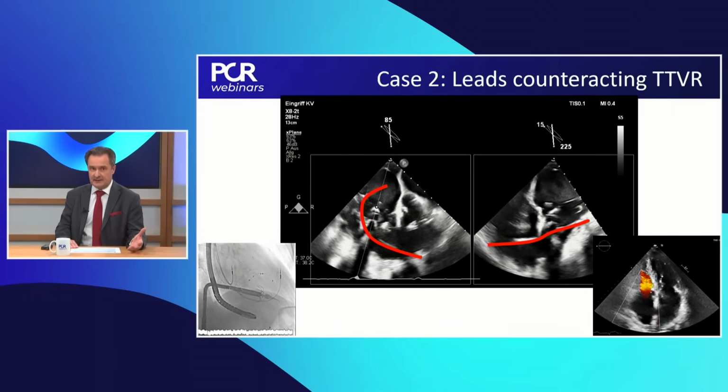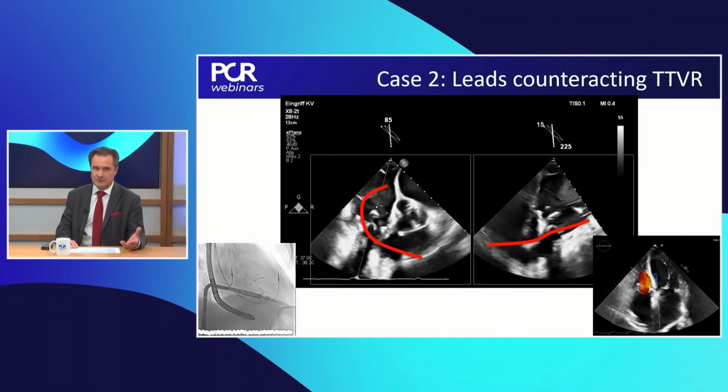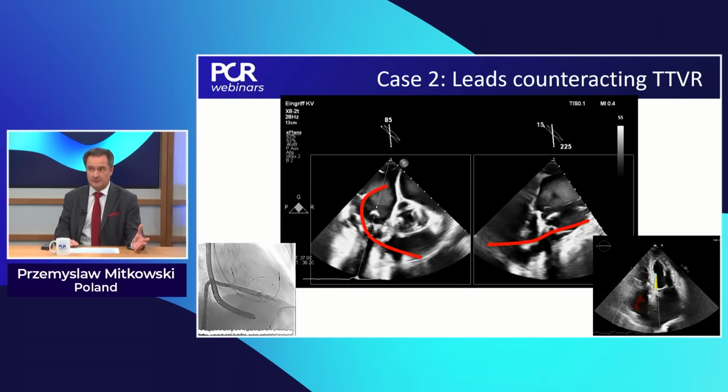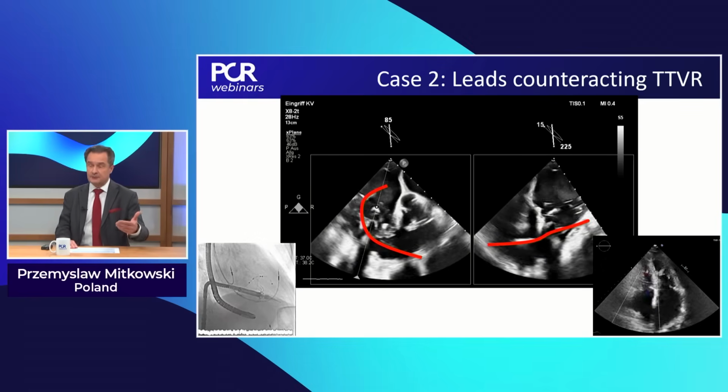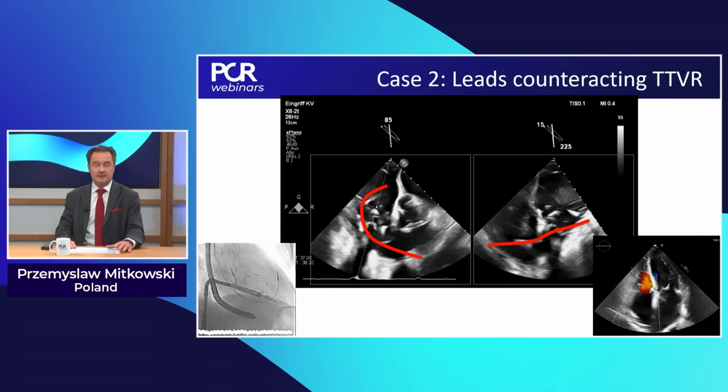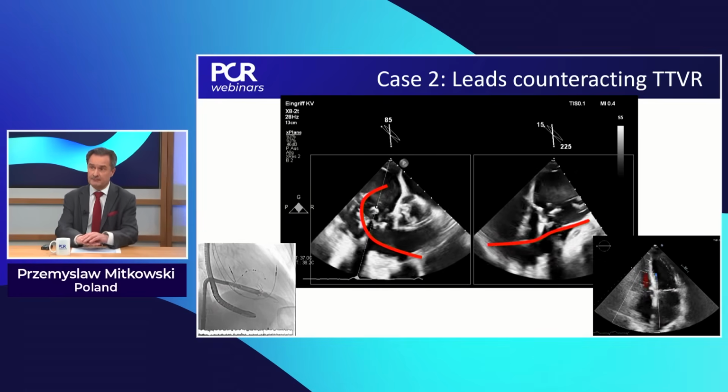And afterwards, after healing the tricuspid valve, when we still have symptoms of heart failure, we can reintroduce the CRT-P. So sometimes a leadless pacemaker could serve as a bridge therapy.